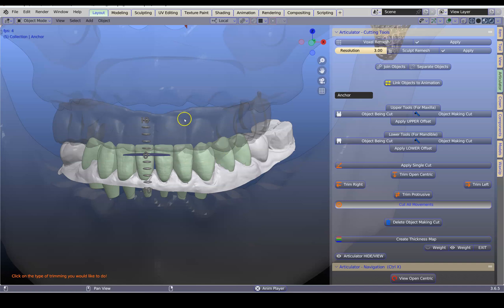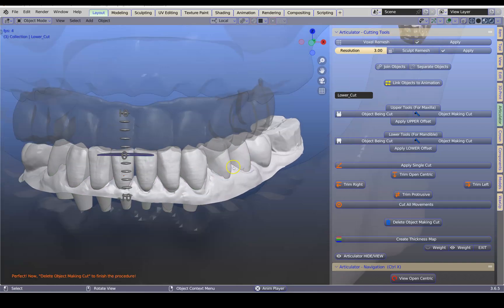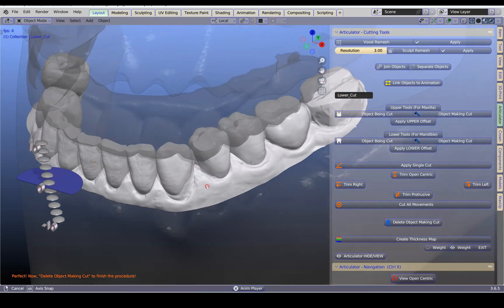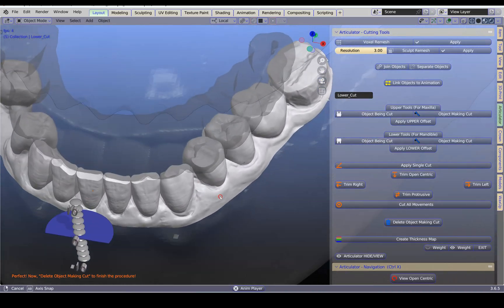The transparent upper model that you see is going to cut through each and every tooth. It will iterate through each individually and perform 13 or 14 boolean cuts. Please be patient while it's doing its work. And voila — they've all been trimmed. I'm very happy with the result.